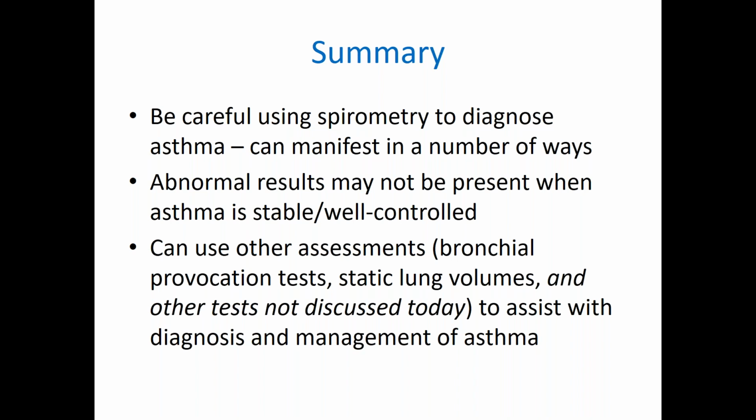Abnormal results may not always be present when asthma is stable or well controlled. And you can use other assessments such as bronchial provocation tests, static lung volumes, and some other tests that I haven't discussed today, but that Greg may mention in his talk following, to assist with the diagnosis and management of asthma. Thank you.